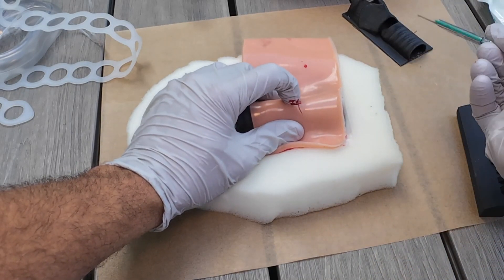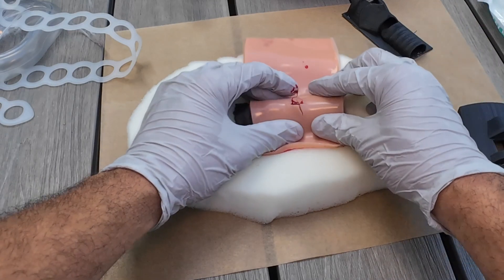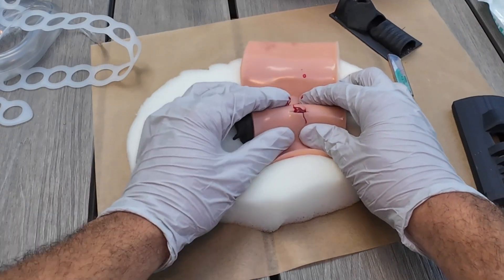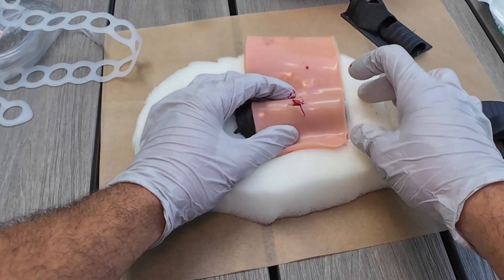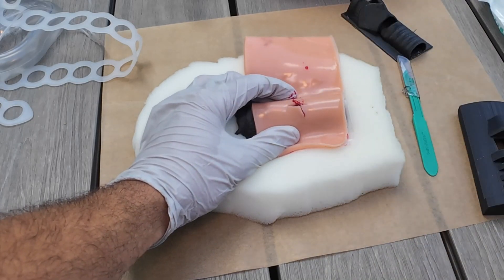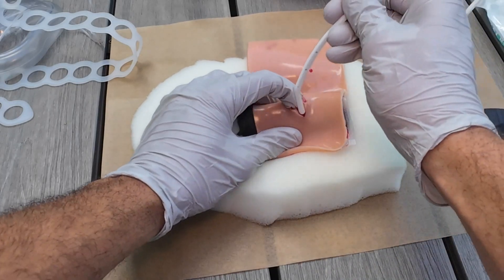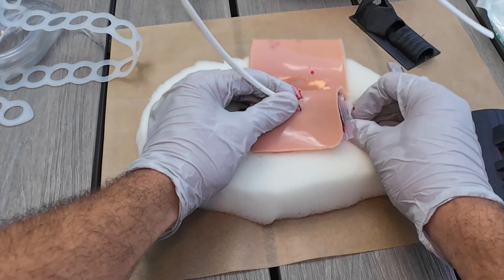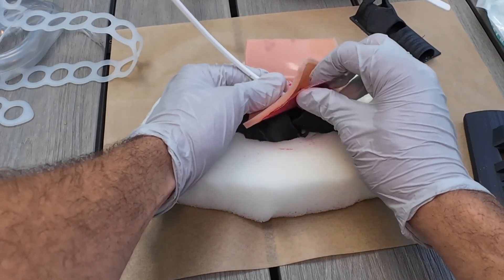If you want, you can put it under pressure too. You can pinch around it so it squirts up. I have this foam here, both so that the stuff doesn't slide, but also that way it kind of absorbs the nastiness.